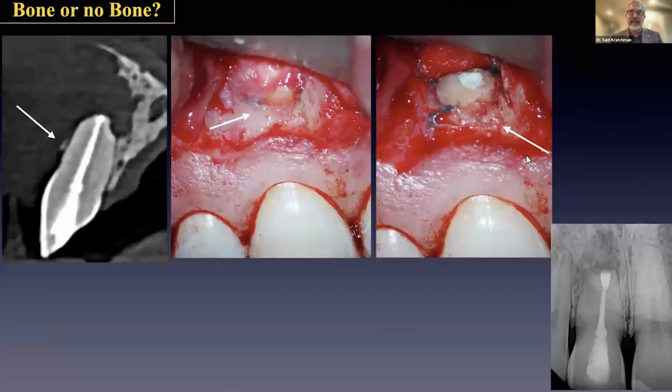Now I'm going to share this, which is not from Morita. And I have a dear colleague who's an endodontist who sends me a lot of cases that I do surgery on. And he often does the diagnosis for me. And he'll send me slices from his cone beam to help. And if you look up here at the slices from his machine, I was nervous that this is the only bone that could be covering the tooth.